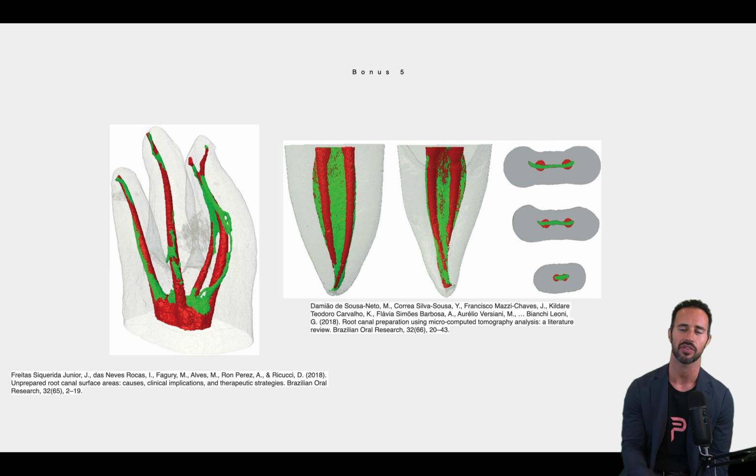All right, that's the secret sauce of endodontics: your disinfecting solutions do most of the work, and you're just creating the space to deposit a lot of sodium hypochlorite. You've got to take your time, especially when you factor in that some of these rotary systems are so time efficient that you're done with your instrumentation in like 20 seconds.